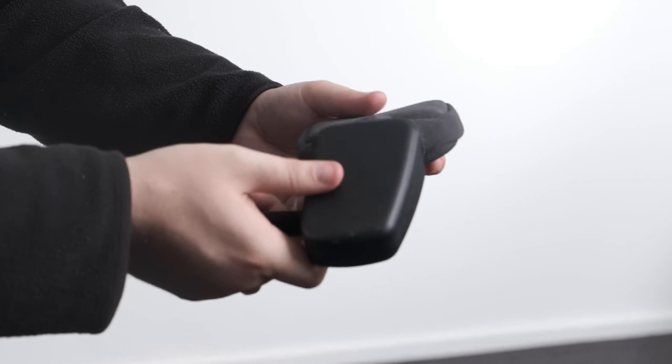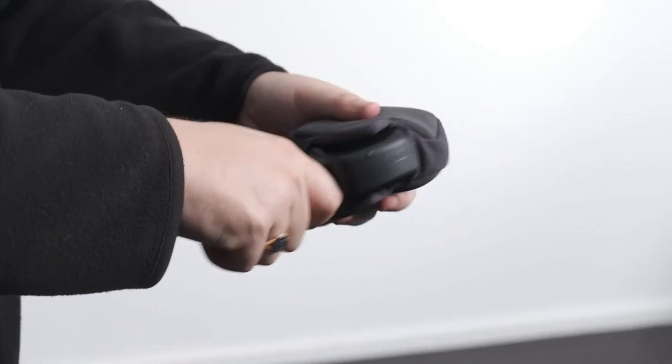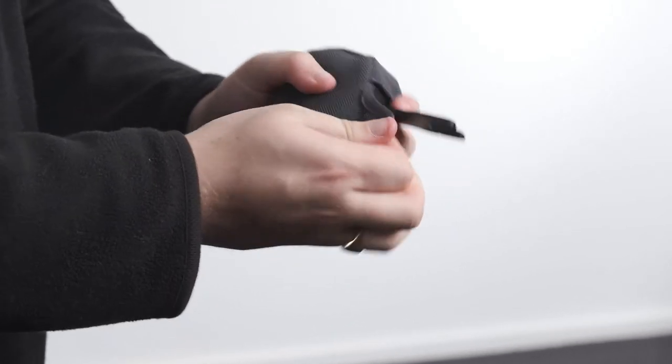Attaching the pommel cover. To attach the pommel cover, undo the velcro and slide the cover over the plastic pad with the velcro facing downwards. Secure in place with the velcro.